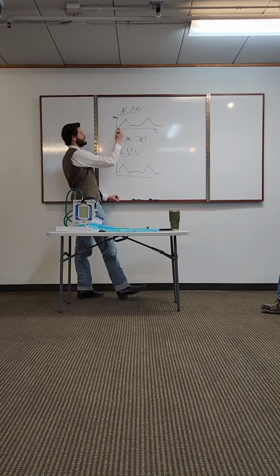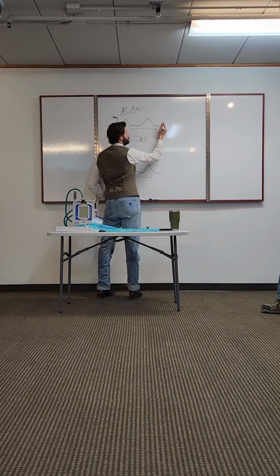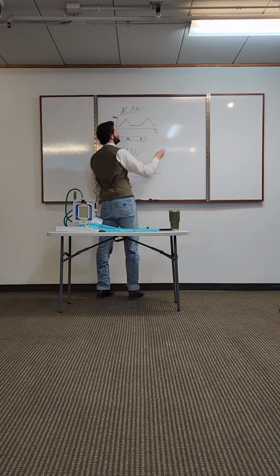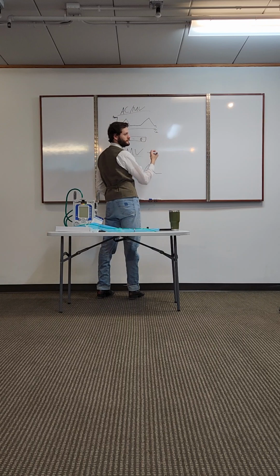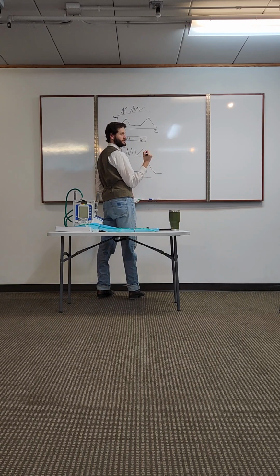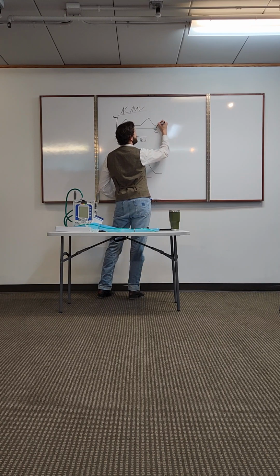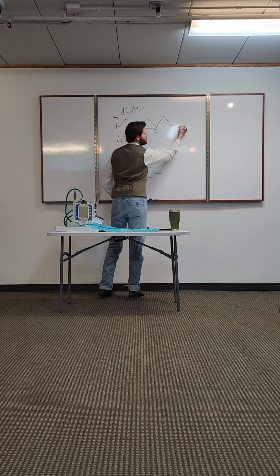If a patient initiates a breath in ACMV, so if right here, obviously it hasn't gone far enough yet. If right here the patient creates a big enough pressure difference in the circuit to initiate a breath, to whatever you set it to, it will give that patient the full set breath and keep going.